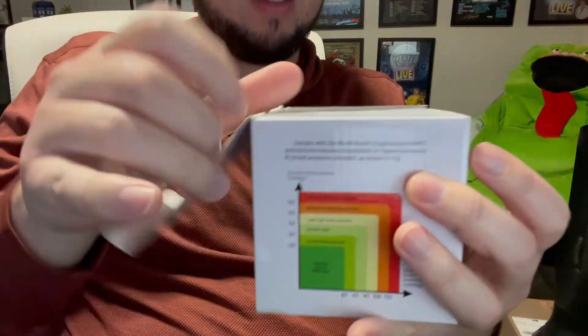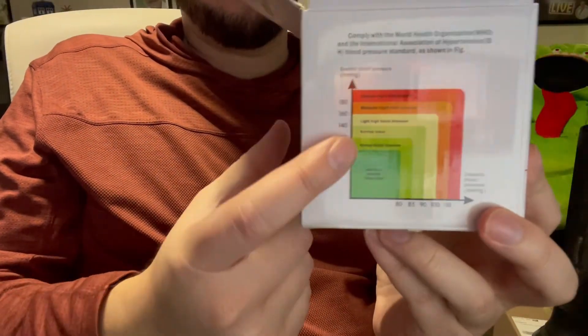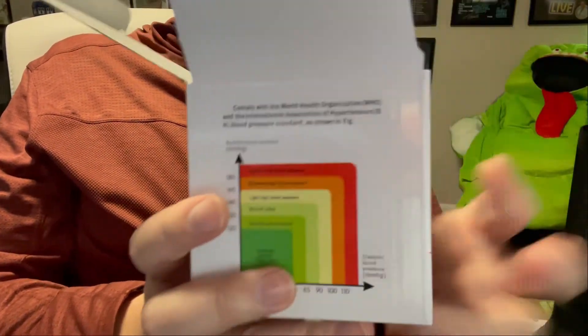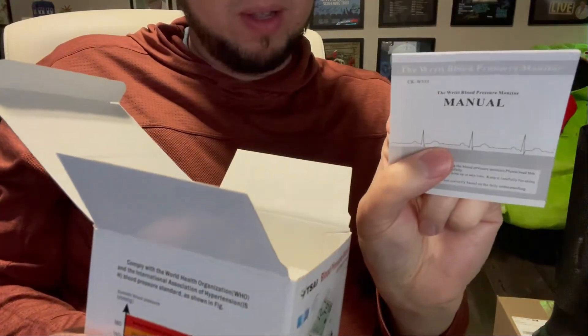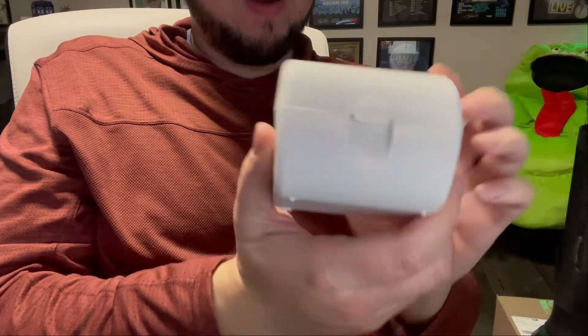We're going to unbox this. By the way, it has a little chart to tell you if your blood pressure is good or bad — hopefully you won't need to keep the box around just for that. We've got a USB charger, a manual, and a little carrying case.